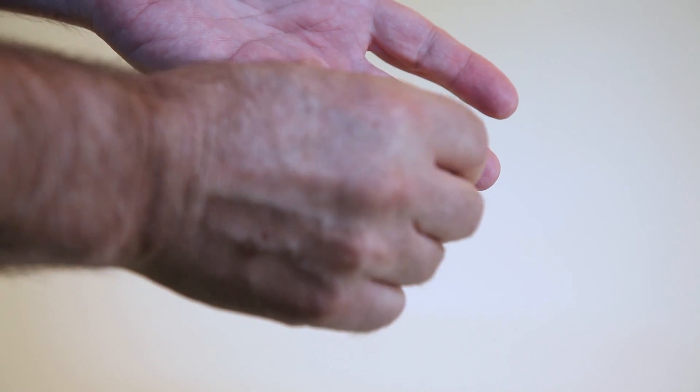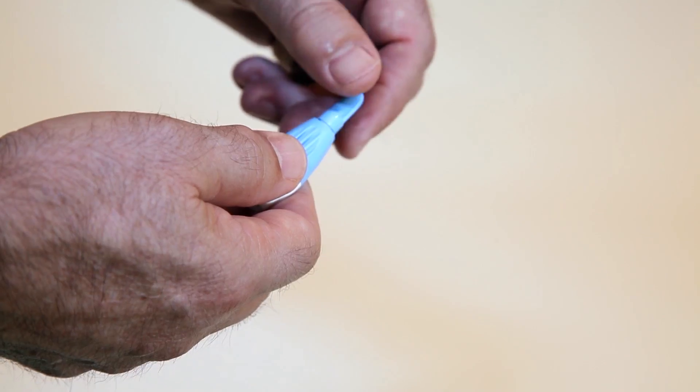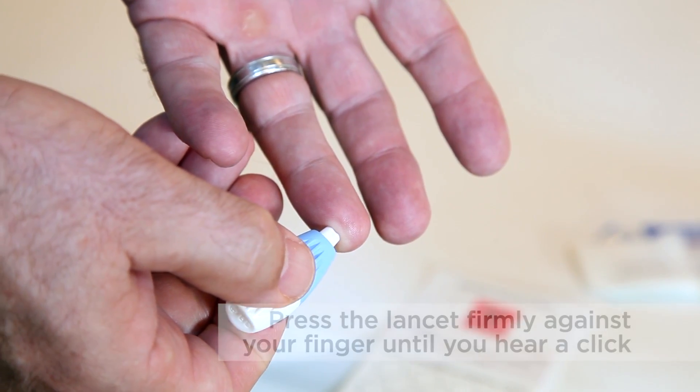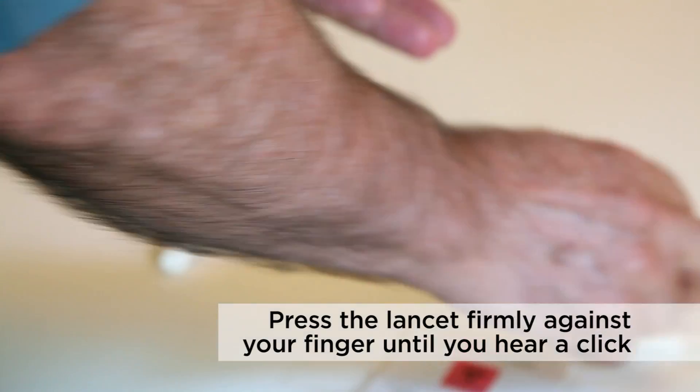It's best to use the inside tip of the middle or ring finger of your non-dominant hand. Remove the cap from the lancet and position the end against the inside tip of the middle or ring finger. Press the lancet firmly until it activates — you should hear a click.